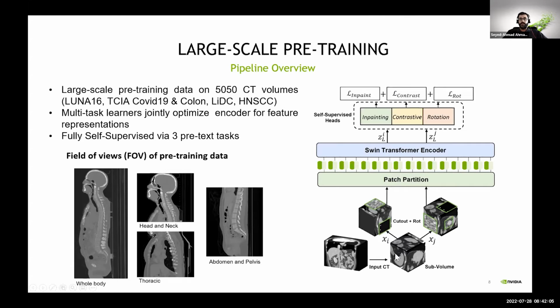So for this, we take this block and we basically augment it in 2 different ways, so that we get 2 different corruptions. On top of that, we also rotate one of the 2 blocks. And the rotation is along the z-axis in 4 variations, either 90 degrees, 180 degrees, 270 degrees, or of course 0 degrees. And these are basically 4 classes.